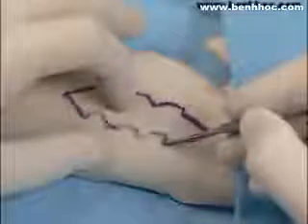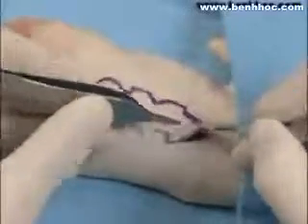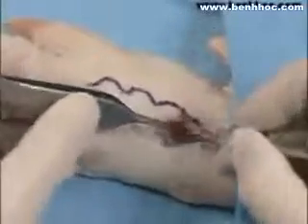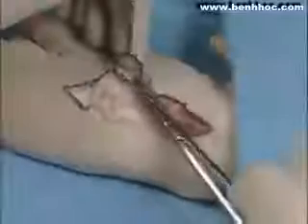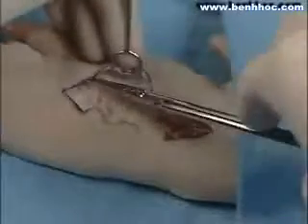Because of the toughness of the pig skin, the geometric shapes here are accentuated, certainly larger than what we would perform on a human in scar revision technique. Here we can see the undermining, using either a 15 blade or the scissors. Note the double hook, and third instrument, as it were, is the middle finger of the surgeon's left hand, while the scissors are dissecting using the tip upward technique so as not to cut any of the important deep structures.